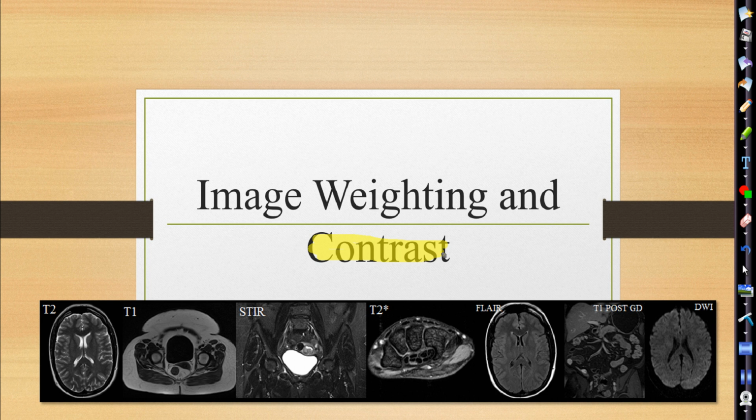High contrast for extremity. High contrast for extremity, you want more black and white to see that bony trabeculation, right? And then low contrast, where do you want to see that? Abdomen, chest. Yeah, where you've got the interstitial lung tissue, it'd be hard to see if it was burnt out. And then the abdomen tissue, where you have all different types of organs.